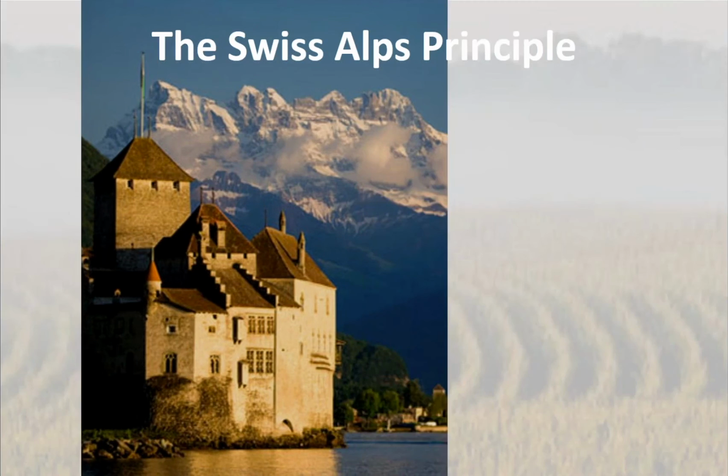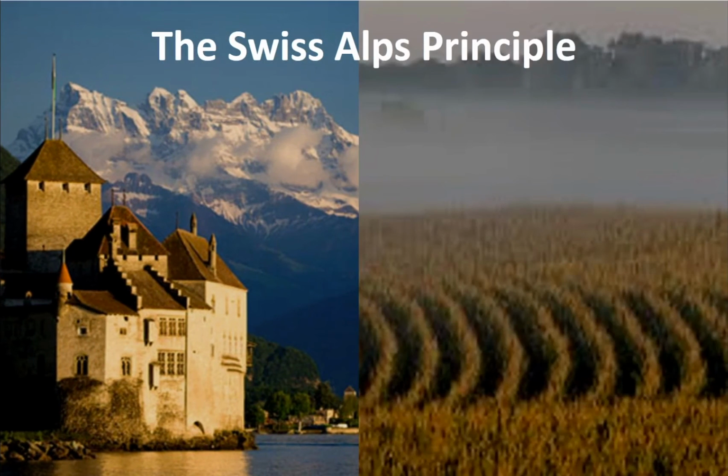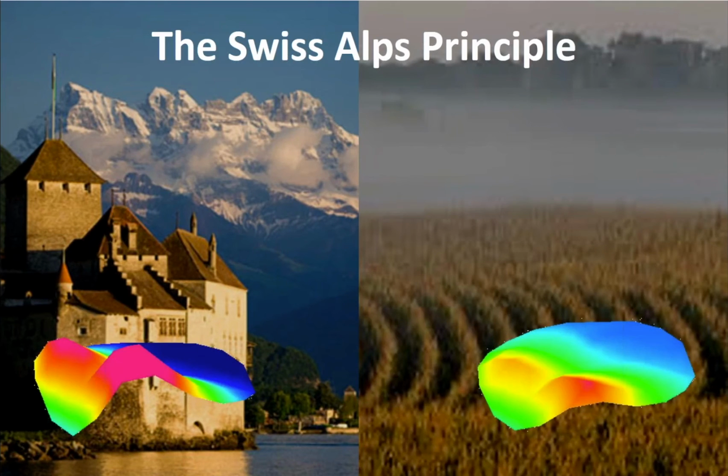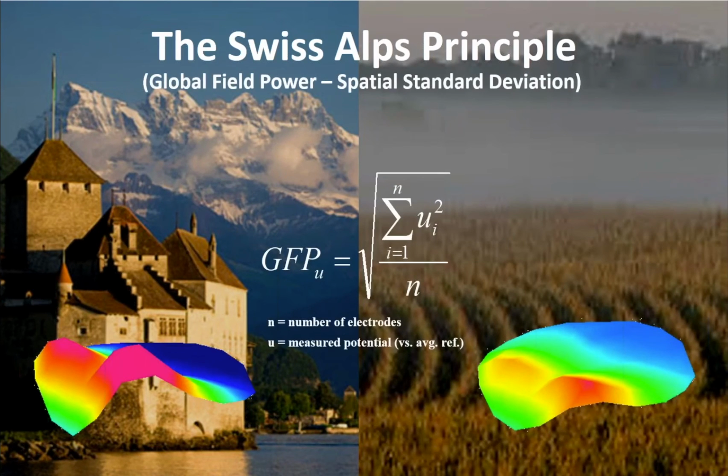So the way you can do this, the way you can measure hilliness or alpness, if you will, is simply using a measure called global field power, which is not mathematically complicated. It's the spatial standard deviation. So the global field power is the root mean squared of all of the potential values at each electrode.